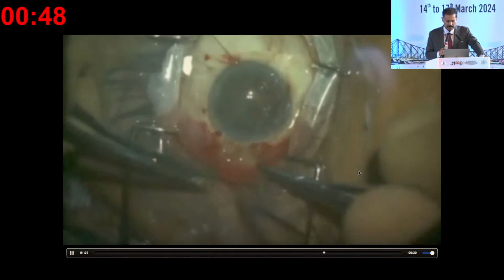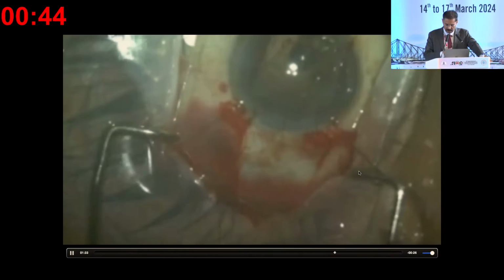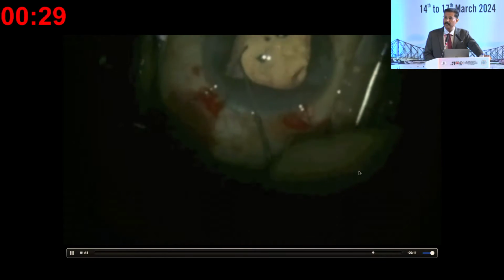And now the incision is sutured, and then we go ahead like what we saw before, put the iris hooks back again, visualize what is there. Is there a capsule rupture, anterior capsule rexis margin rupture? If not, you can continue the vitrectomy and place the IOL in the sulcus and have outcomes as good as a regular normal case.